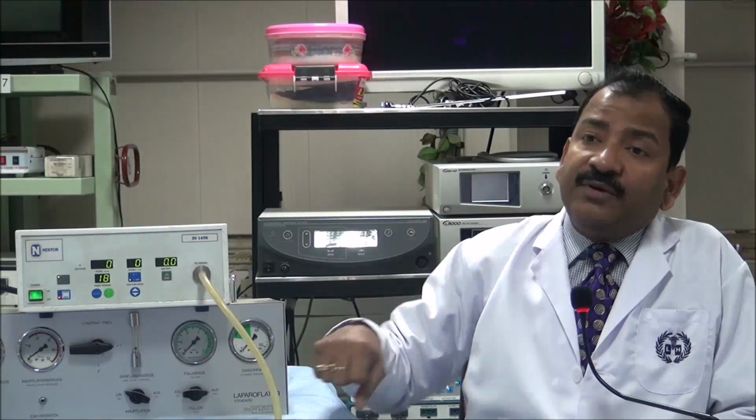What are the problems? Decrease in venous return, decrease in cardiac output, decrease in tidal volume, decrease in minute volume, decrease in renal perfusion, cerebral edema, hypercarbia, and then a lot of problems like DVT and all these which we have discussed during the advantages and disadvantages of minimal access surgery. All the complications will be quadrupled, and the rate of absorption also will be faster. So after 18, any laparoscopy is not recommended.